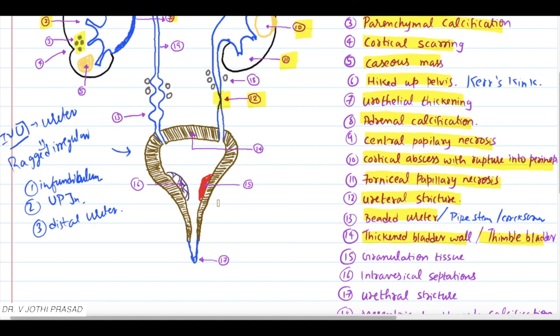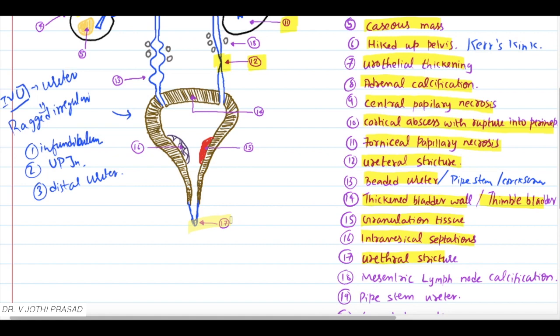Other minor conditions seen in contrast CT are granulation tissue and intravesical septations. The 17th finding is urethral stricture. This one is granulation tissue over here, and this one is an intravesical septation.